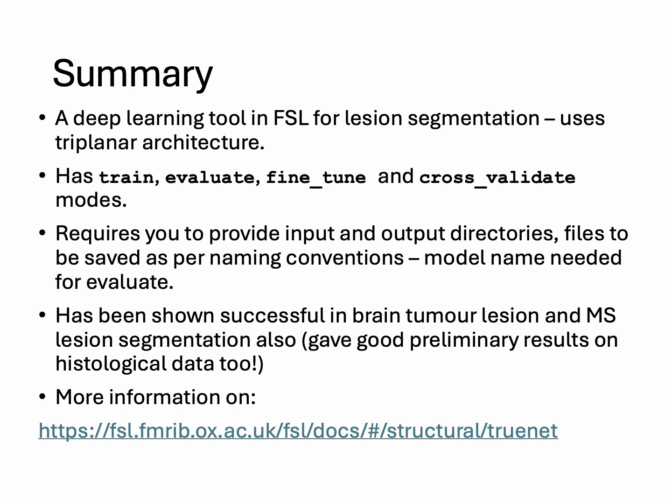And as I have shown some example applications and results, we have seen promising results in various applications, including tumor segmentation and MS lesion segmentation, apart from the white matter hyperintensity segmentation. And we did get some preliminary results on brain histological data as well.